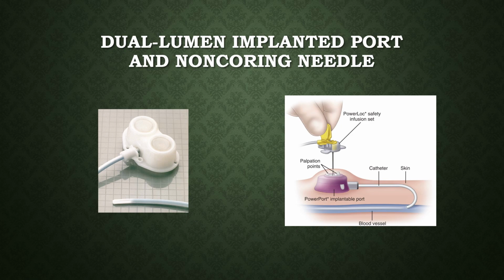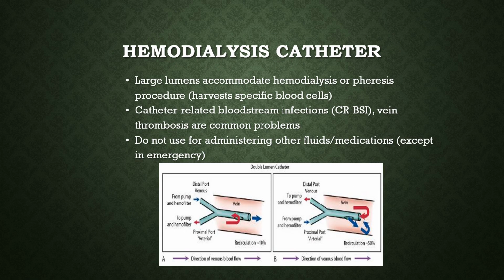There's too much of a risk of infiltration with chemo and a peripheral line, because if you infiltrate an IV with chemo, you could lose... I've seen patients that lost an arm. It damaged the tissue so severely they could lose part of their arm, or all their arm. So chemo is mostly given through central lines or through some kind of implanted port like this.